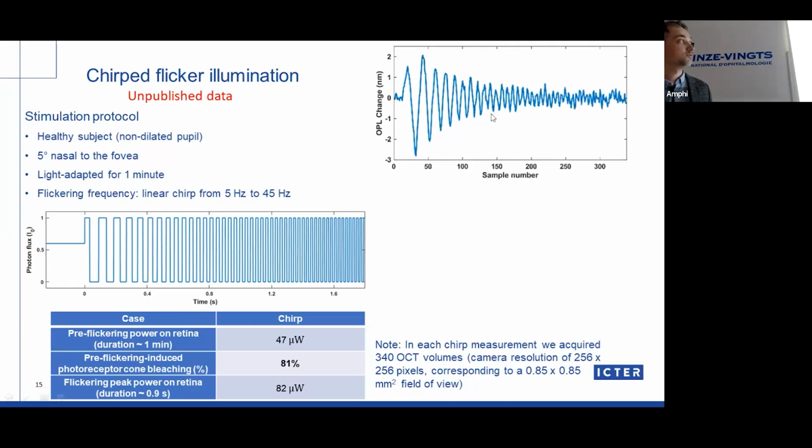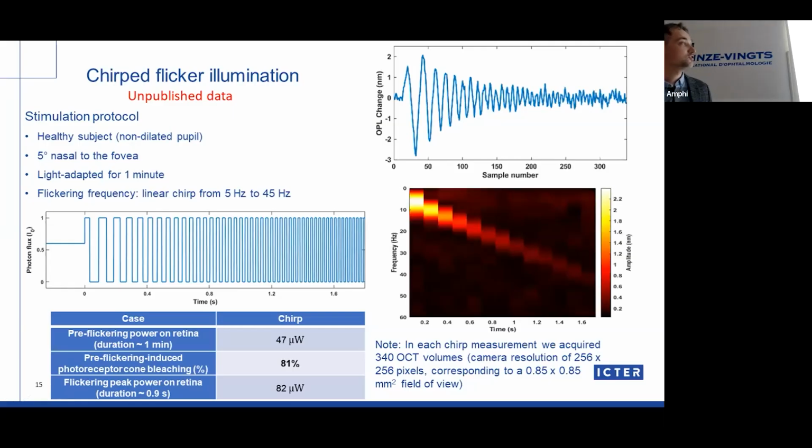And this is average from 5 measurements. And from such measurements, we compute spectrograms, from which, with the short time Fourier transform, we are able to extract the amplitude of the response. So, for example, we know that in this time window, we have average stimulus frequency about 7.5 hertz. So in this time window, we reach response at the 7.5 hertz, and so on.